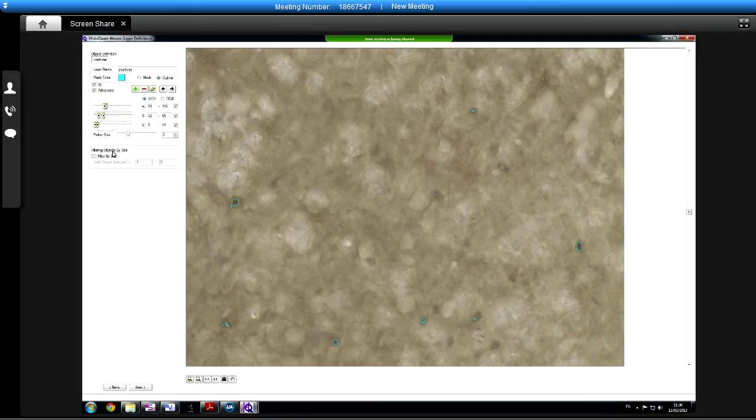So we look at these now. That's a true positive there, isn't it? I think, for instance. Yeah. So that is obviously not being picked because of the colours I picked. So let's click on that a bit more. Okay.